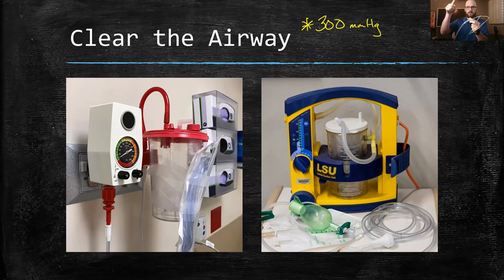Otherwise, when that machine is running, it'll be sucking air through here, not through that tip that we're actually going to use to suction the patient's airway. Once we cover that up, we can test and see that the suction's working for sure. These flexible suction catheters work well if a patient's intubated and you or the medic are going to suction down the endotracheal tube, because it's a lot more flexible, it can move and bend with it.